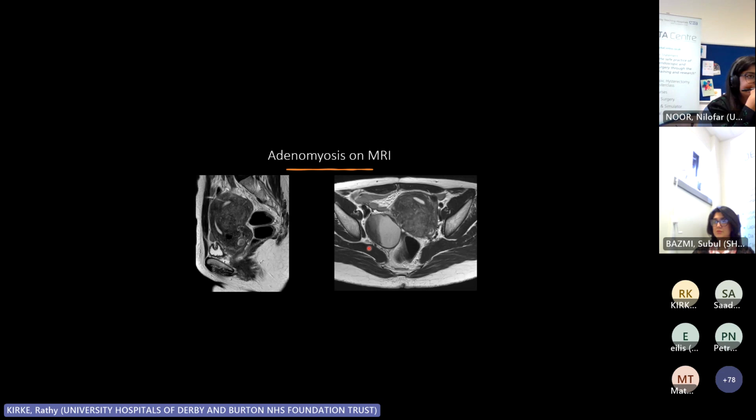It's fairly obvious to say this is it. You're 100% specific with it, and it's very sensitive. You've also got a lovely endometrioma sitting right next to the uterus, with a few little bands of adhesions. This is definitely stuck to the uterus. You can see there's absolutely no fat between them. This is fat, the white bit's fat. There's no fat between the uterus and the ovary. This is going to be tethered to the posterior uterus.